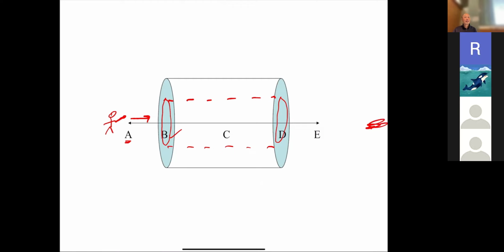Okay, go ahead. I was going to say C, probably where the center of the magnetic field is. My assumption is once it hits the center, it might hit equilibrium somewhere around there. Good. And the center of the magnet, just so we start introducing terminology, is what's called the isocenter. That is the center of the magnet. Okay. Any other thoughts on where this will go?